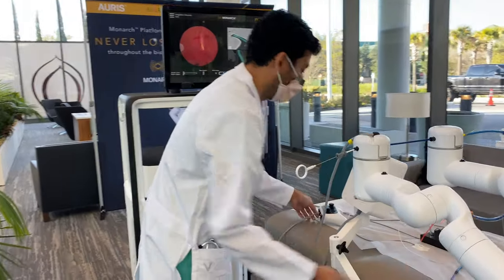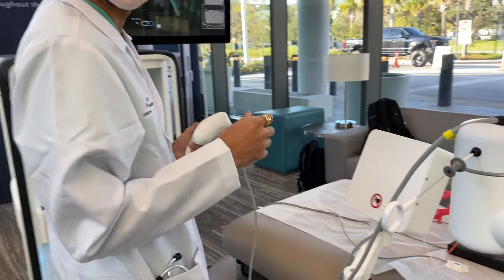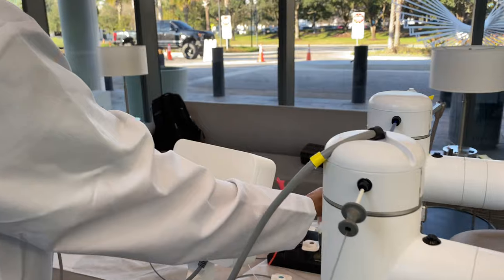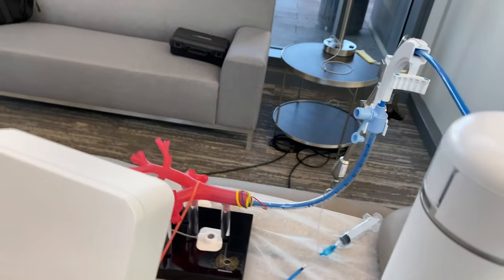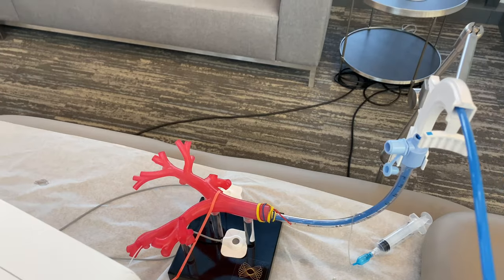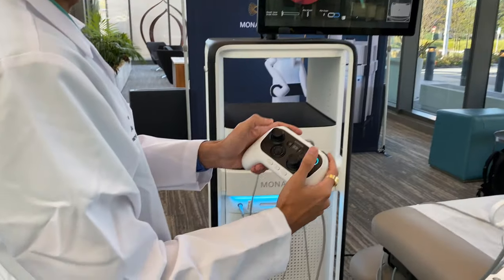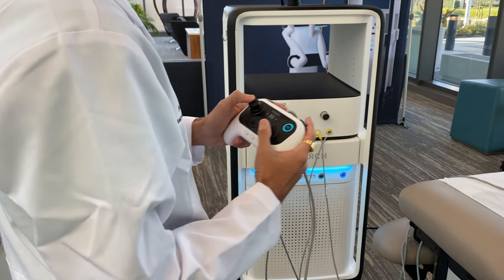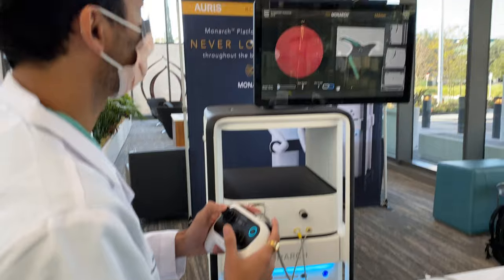So let's start the demonstration. We have no difference in airway management for the patient. It starts with a breathing tool for the patient, as demonstrated here, and we have a lung model that's colored in red. So now we're going to start with the controller here. We have joysticks and other functions, and I'm going to try and guide everyone as we drive to our target.